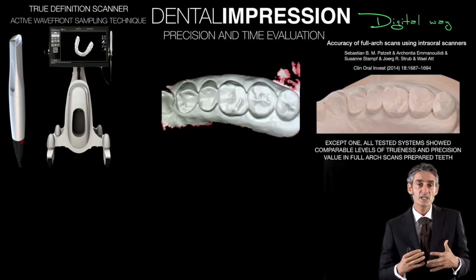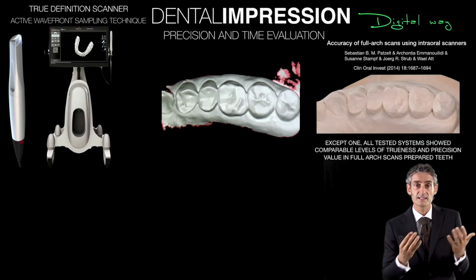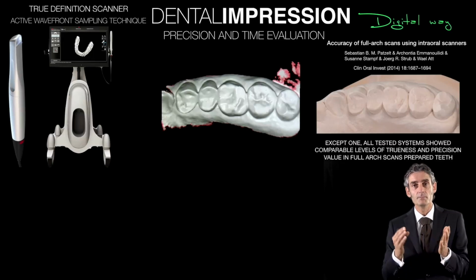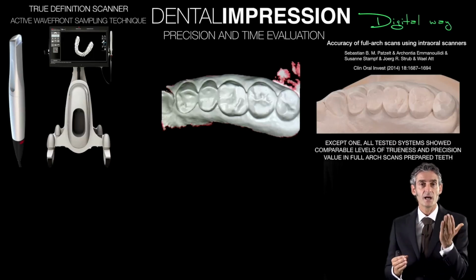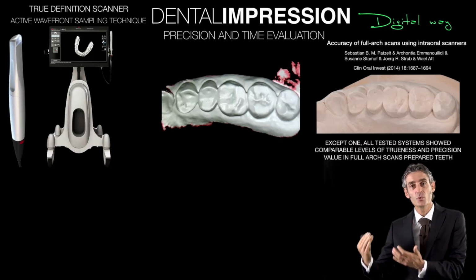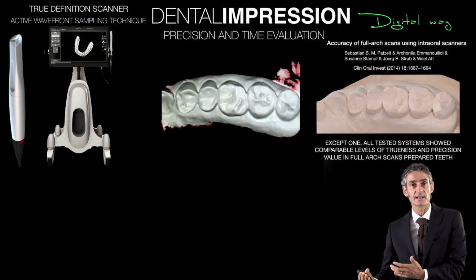And then when we finish, for sure we have a result that is what you can see on the screen, so it's a digital impression. But what are the most important differences? Our digital impression is already a cast. We don't have to pour the impression to obtain the cast.